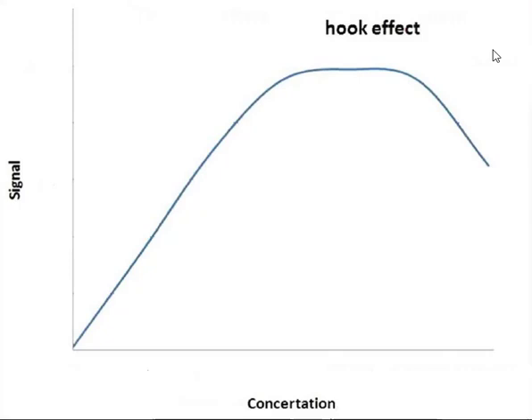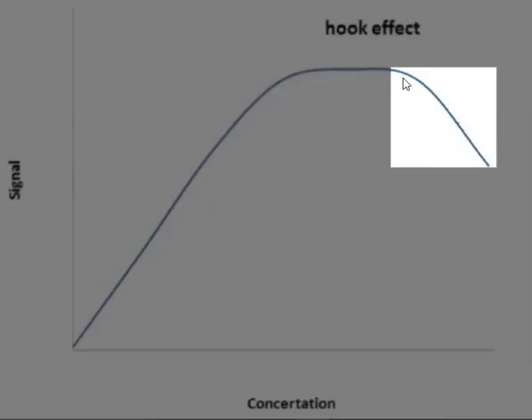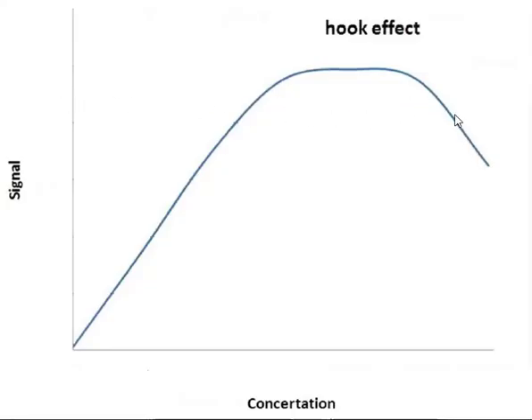During the wash step, unbound detection antibodies are washed away from the reaction environment, and after adding chromogen substrate, if there is any complex including capture antibody, analyte, and secondary antibody, we see the signal, but as I mentioned before, it's not representing the real concentration of analyte and gives falsely low results. What happens here? The signal that is caught is lower than the actual signal, and so the concentration is not real.